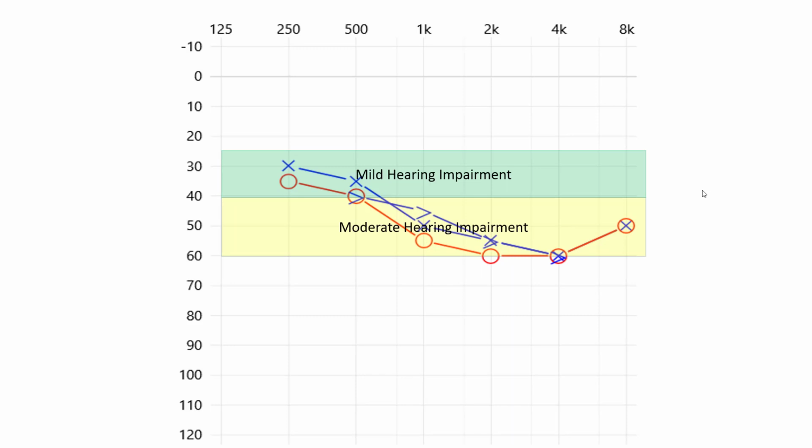A bone conductor is a solid device placed on the back of a patient's ear, just behind the ear actually, on the mastoid bone usually, but it can also be placed on the forehead. This device will vibrate. That physical vibration of the bone will send a vibration through the cochlea, well, through the fluids in the head. By vibration of the bone directly, it will distend the cochlea itself. Basically, the energy will arrive inside the inner ear, and it doesn't have to go through the outer or middle ear system. So we can almost imagine it as a direct measure of the cochlear function or inner ear function.